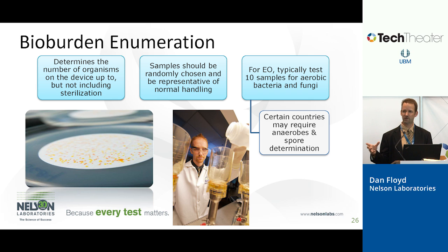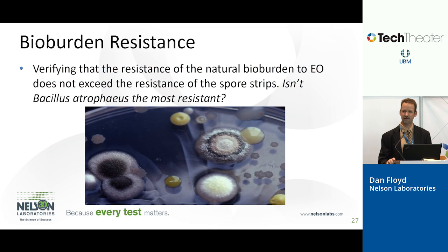As you add new people to your clean rooms, new raw materials, maybe you change vendors, all of that can affect your bioburden. You'll see it go up and down, even with the seasons. When it's warmer and wetter out, with more humidity, you'll see higher bioburden levels than maybe in the winter when it's colder and drier. And so all these can affect that. That's why you monitor. It's a test you have to keep doing just to see what the bioload on your product is.